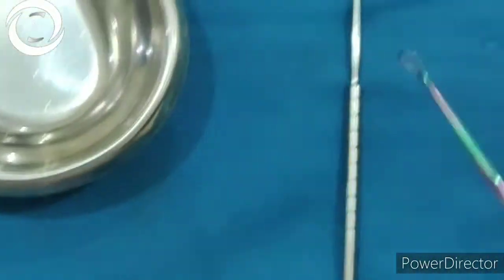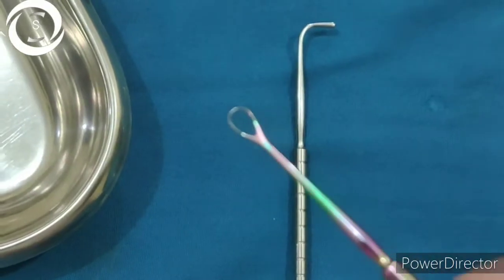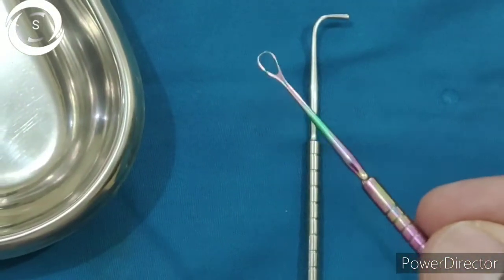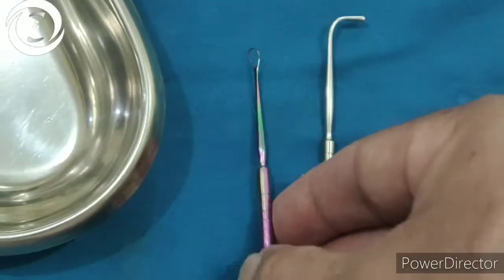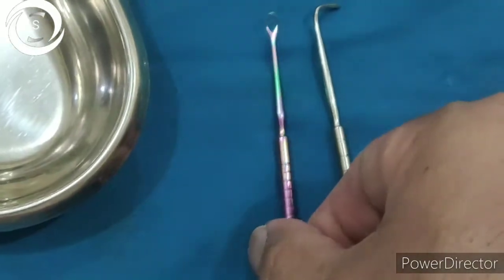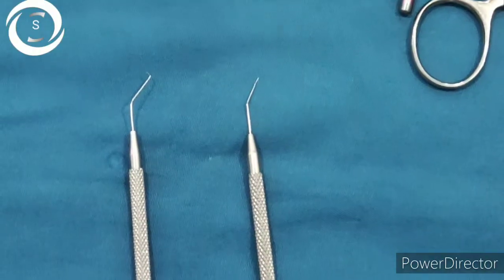By putting pressure on the cornea and creating positive pressure inside the eye, the nucleus is delivered. This is the wire vectis — it is a ring-shaped loop used in retrieving and delivering the nucleus or a subluxated lens, preventing it from falling back into the vitreous during complicated cataract surgery with posterior capsule rupture.